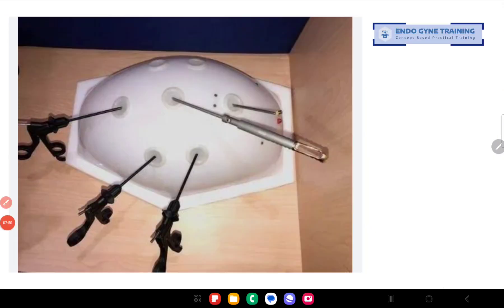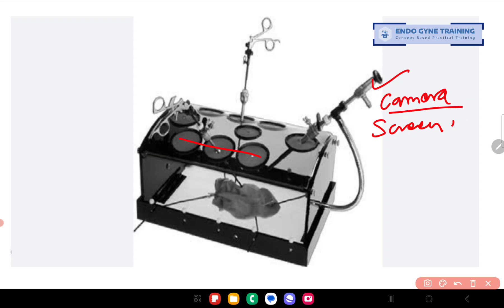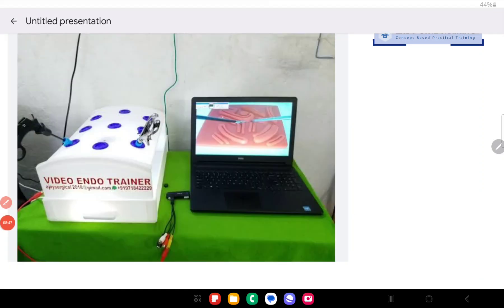Looking at some other pelvic trainers available on the market: this first example has ports in the same line, which I find difficult for ipsilateral — though if you are doing contralateral using the outer ports, that is fine. The next one also has ports in the same line, which is difficult for ipsilateral. This model has the added advantage of having a telescope inside, but it requires a separate camera and screen. The models I showed earlier already have a camera and light built in, so you can have a standalone system anywhere in your clinic or home and practice with a regular household TV screen.